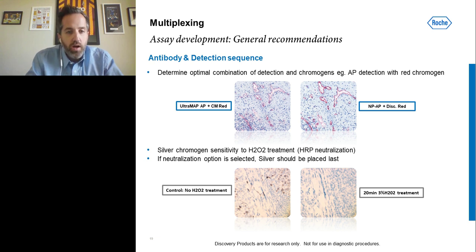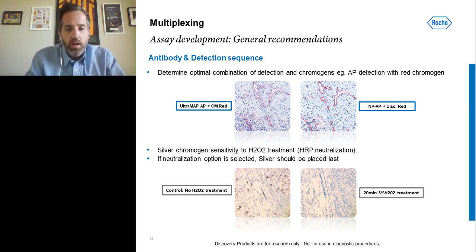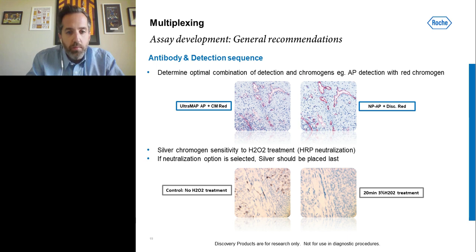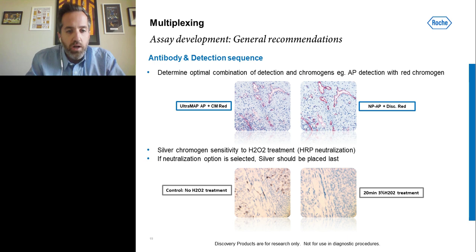Antibody detection sequence is also of key importance. We've got two examples of the same stain using different types of detection. On the left-hand side is multimer detection, and on the right-hand side is hapten-based detection. You can see the increased sensitivity and specificity of the hapten detection gives a more optimal signal. So it's important to ensure you're using the best possible detection before you create the multiplex assay. If you plan to use silver detection, it's important to be aware that it can be affected by hydrogen peroxide treatment or HRP neutralization, and should be placed last in the sequence.